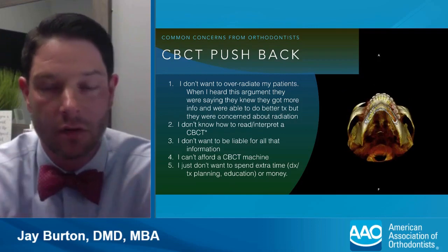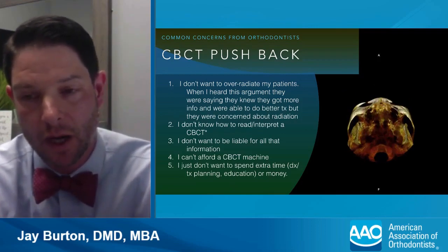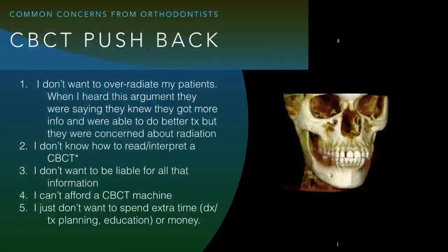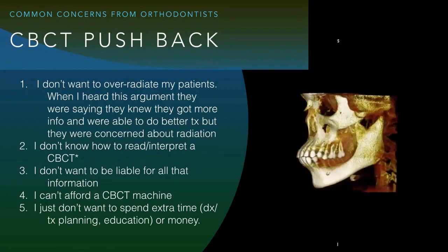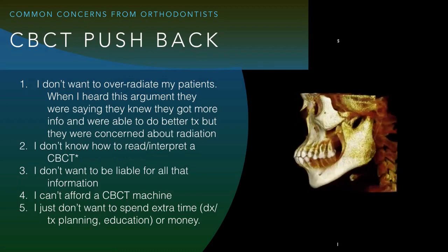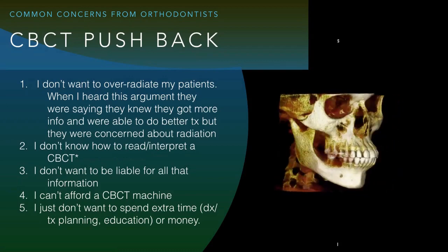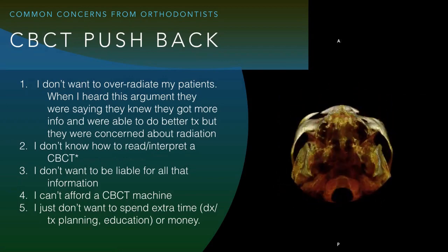is I don't want to overradiate my patients. And what I've found is, over the last couple years anyway, most doctors are at least aware now that ultra-low dose machines are available, and that they actually image patients at a lower dose than 2D radiography, even 2D digital radiography. So that's really become a non-issue. Number two, I don't know how to read or interpret a CBCT.